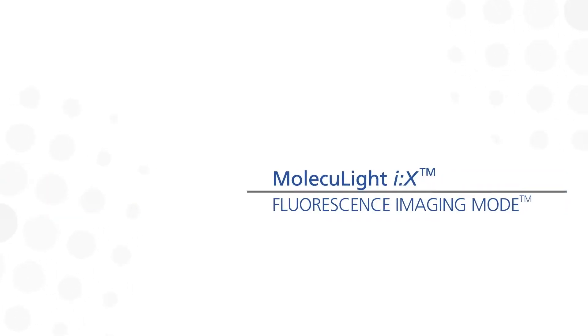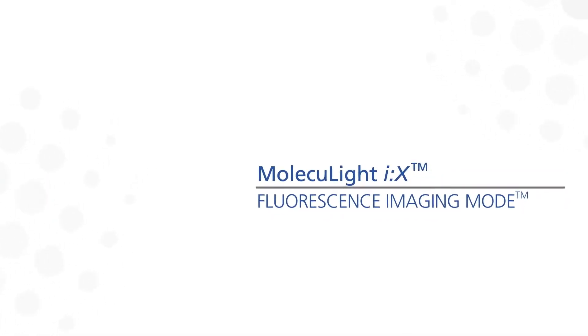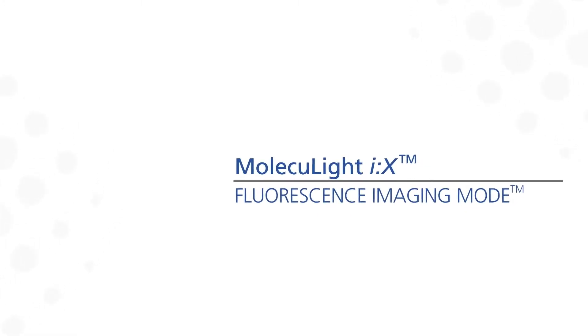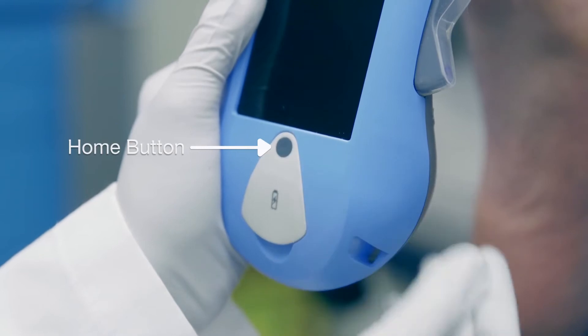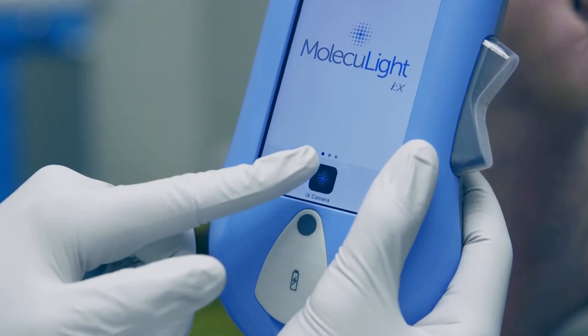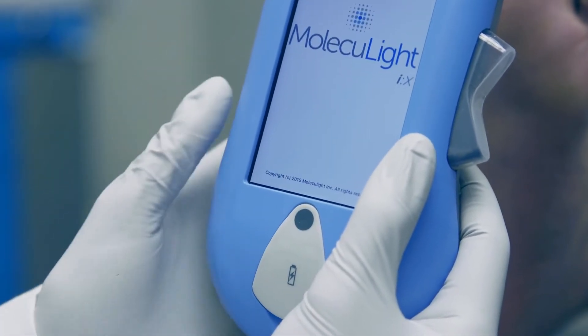Taking a fluorescence light image is quite similar to taking a standard light image, except a fluorescence image allows for visualization of bacteria. First, press the home button to turn on the display screen, then slide the slider and select the iX Camera app, but now turn the room lights off.